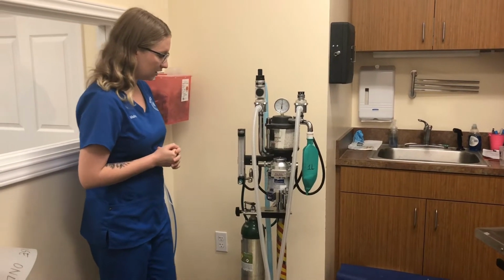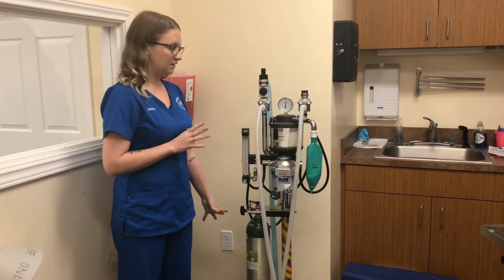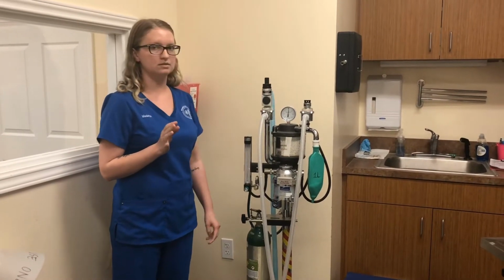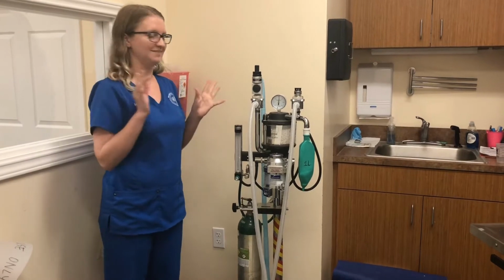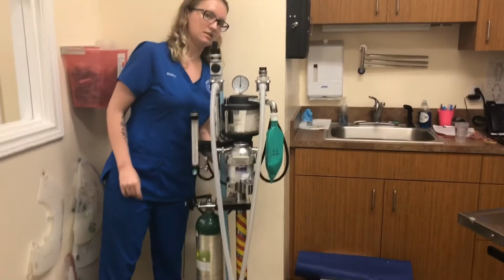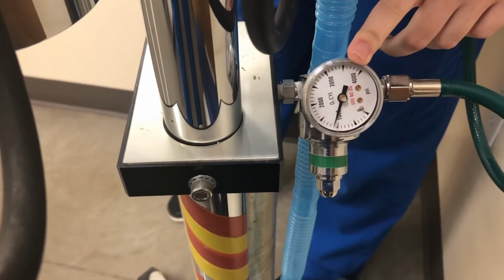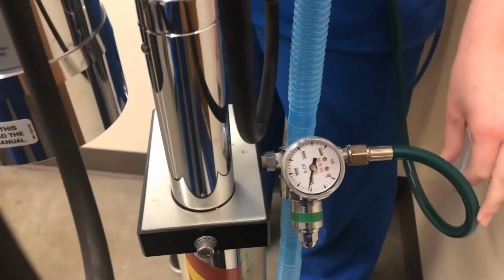To start, I'll go over our oxygen tanks. We have E tanks here. E stands for emergency. There's also H tanks that some clinics have, but we don't have those. Those are the big tanks that lead into each room. H stands for huge. But our oxygen tank is here, and if you turn this on, lefty-loosey, righty-tighty, you can see the valve. This has about 1,000 psi in our tank, so that would be enough for a couple surgical procedures. And the oxygen flows from this green tubing here.